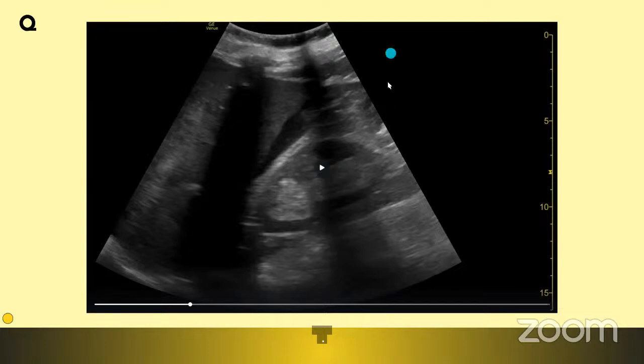Yeah. So let me reveal to you. Since I told you this is the liver and this is the right kidney, you can see here, let me put a star mark, this space. Here we are getting a hypoechoic area, right? This is complete acoustic shadowing, leave that. So here we are getting some blackish area.